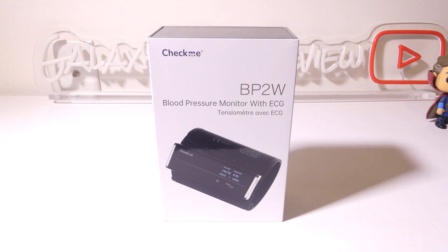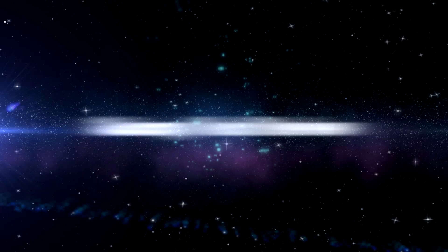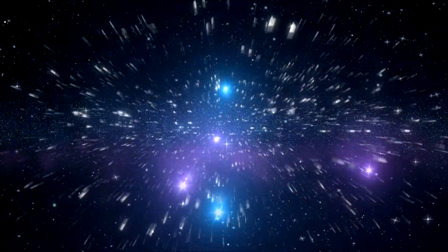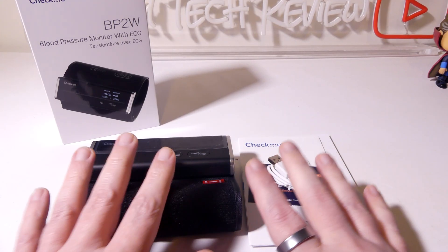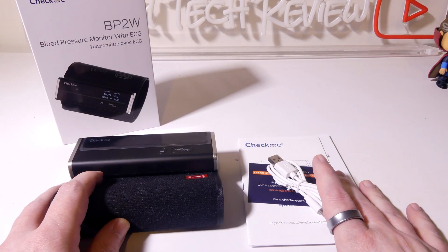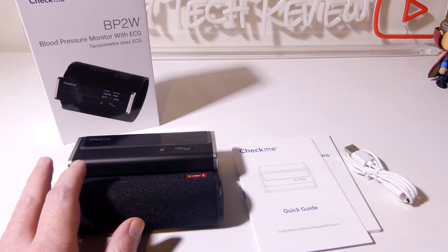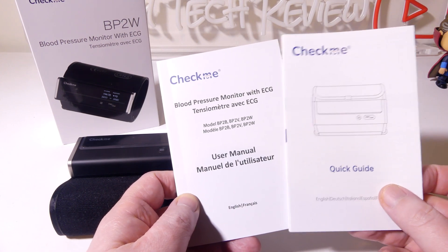We're going to dig into this now, and I'll be right back. Let's check out everything that comes in the box with the BP2W. You do get a warranty card from CheckMe — hold on to that. You also get a quick guide and a full user manual.